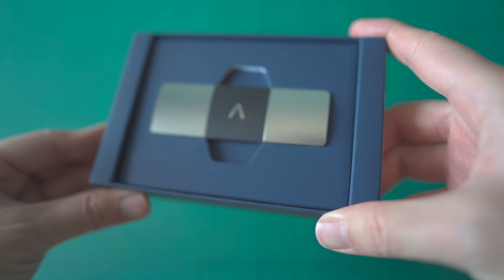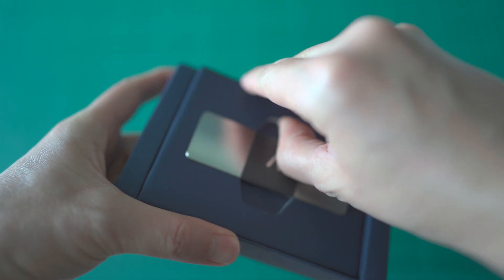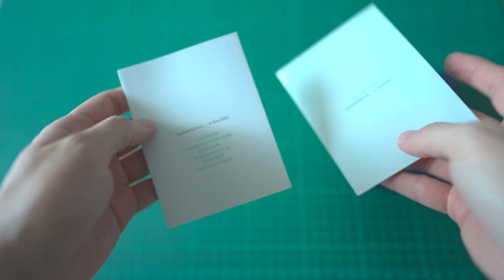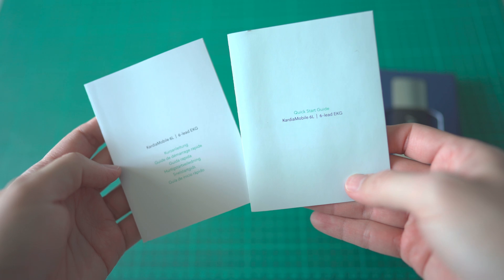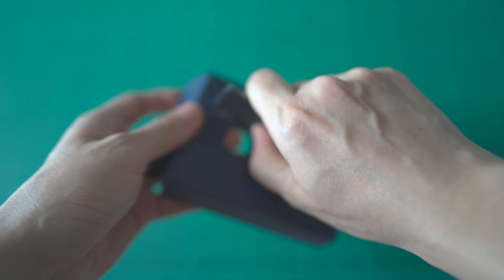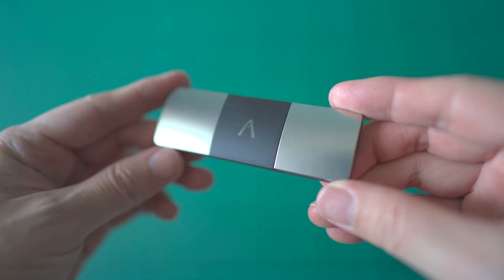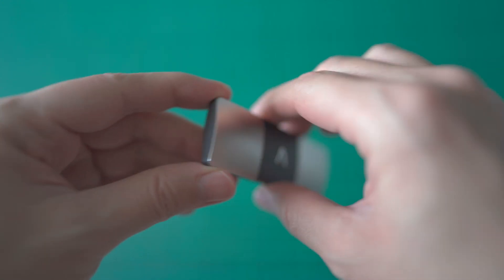Inside the box, you will find the Kardia Mobile 6L EKG and Quick Start Guide. The Kardia Mobile 6L EKG has two electrodes on the top for your fingers and one on the bottom to contact the skin of your left leg.